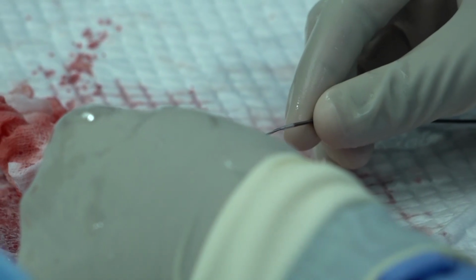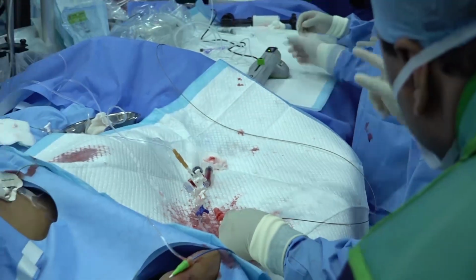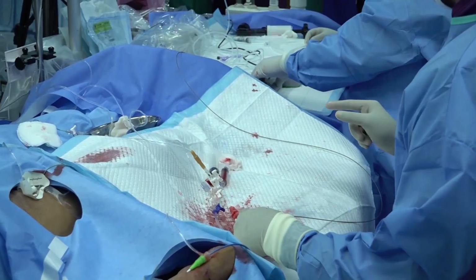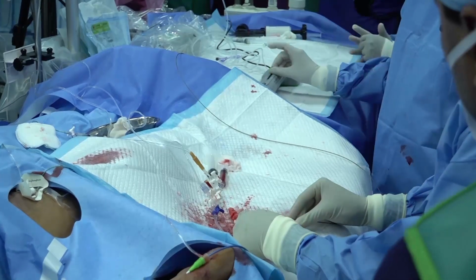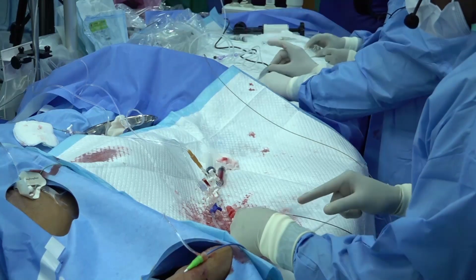Okay, we'll switch it on. The switch on button. One minute. Lock. I think the brake is not fully down. Okay, now it's down. Now it is click. Okay, now that's good. We'll switch it off. So we have seen that it's working front and back.